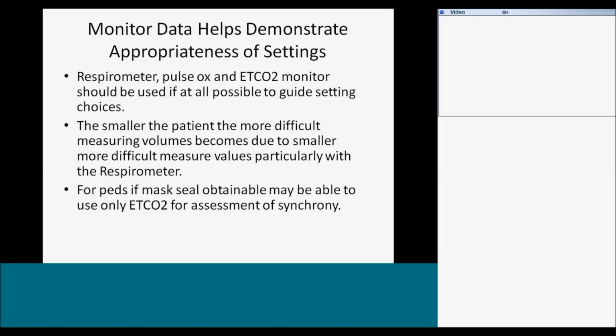As I said, for pediatrics, sometimes you can't get a mask seal, and you're not going to be able to use end-tidal CO2 because you have so much of a leak, but you can maybe use it to determine synchrony and make sure that the waveform matches the waveform on the machine. All your patients, you should be able to monitor pulse oximetry.